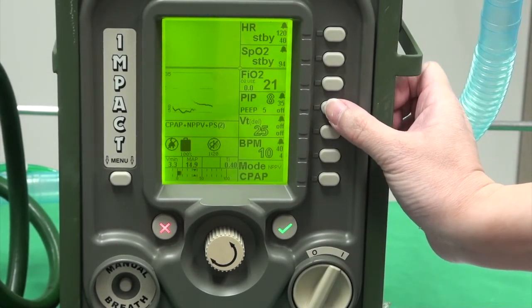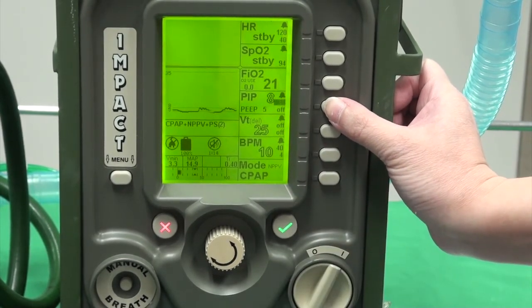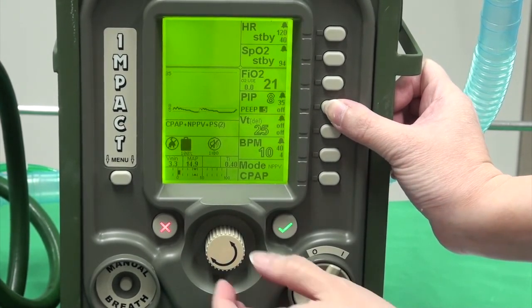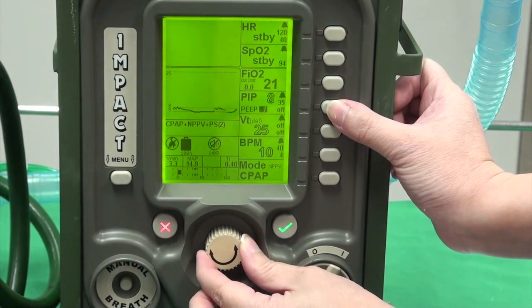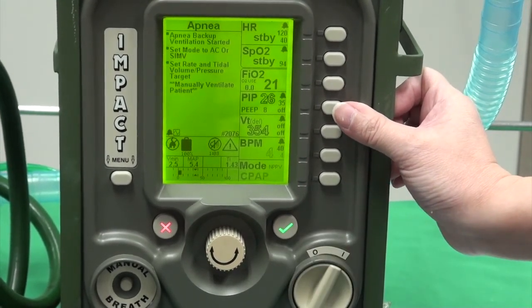To change the EPAP, press the button next to the PEEP. Toggle to the number that you want to change and change it to the number that you want. And again, press the tick.